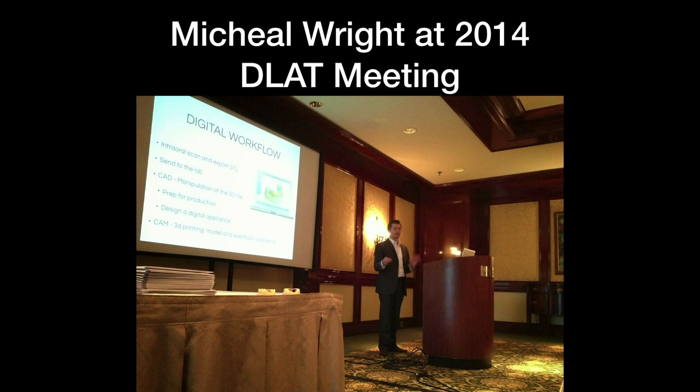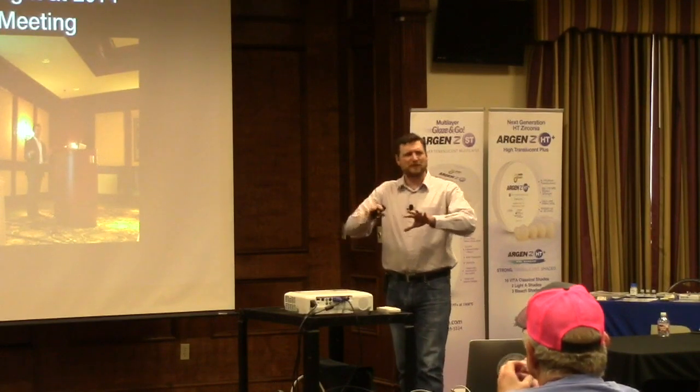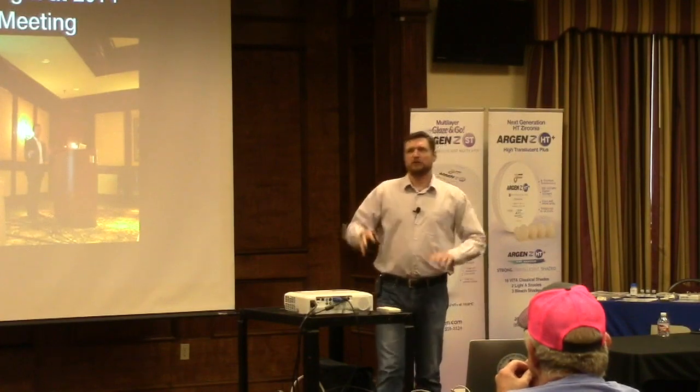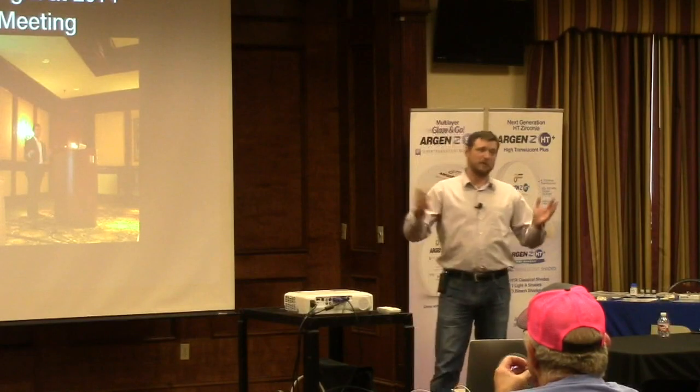Now, ortho labs are a little bit different than Crown and Bridge. Y'all got your digital early, CAD/CAM, milling, all that stuff. The subtractive stuff didn't work for ortho, but the additive stuff, the 3D printing, when that started coming along, that really changed the game for us. Before then, it was just plaster models.